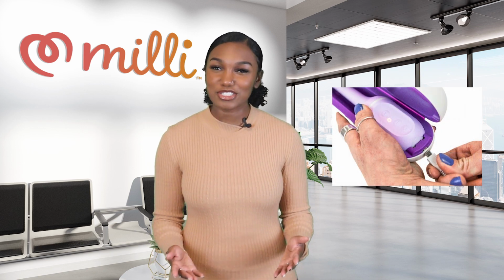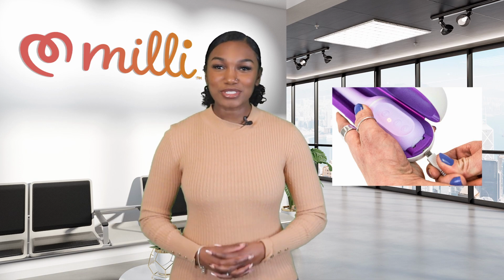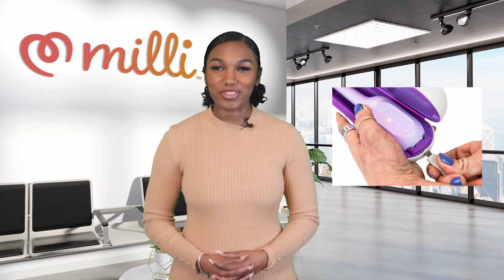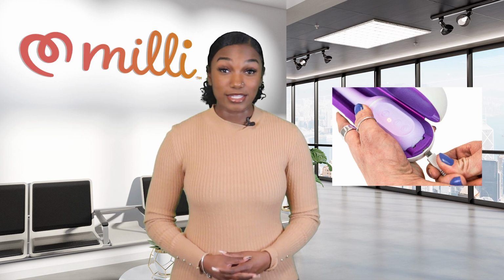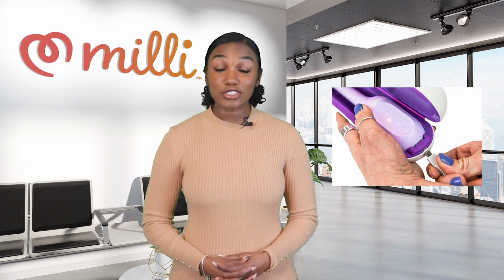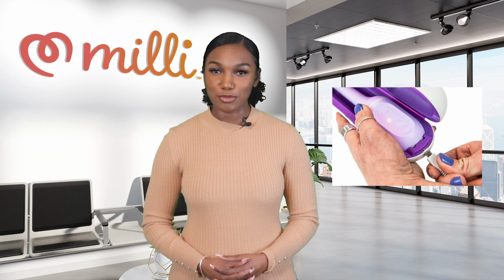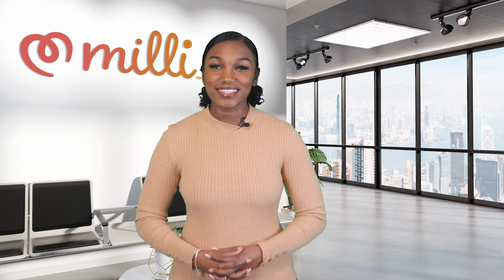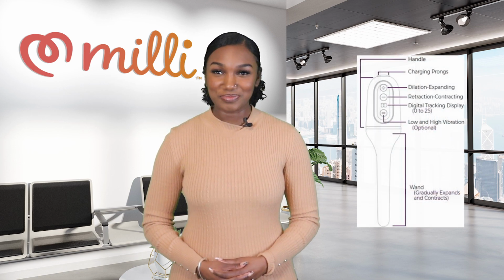The Milli device is stored and charged in the discreet Milli charging case. Once you receive your device, you should connect the charging cable to the port located on the side of the charging case and then plug it into an outlet. While the device is charging, you will see a faint orange light emitting at the port. Your Milli device will flash an orange CH, indicating that it is charging.